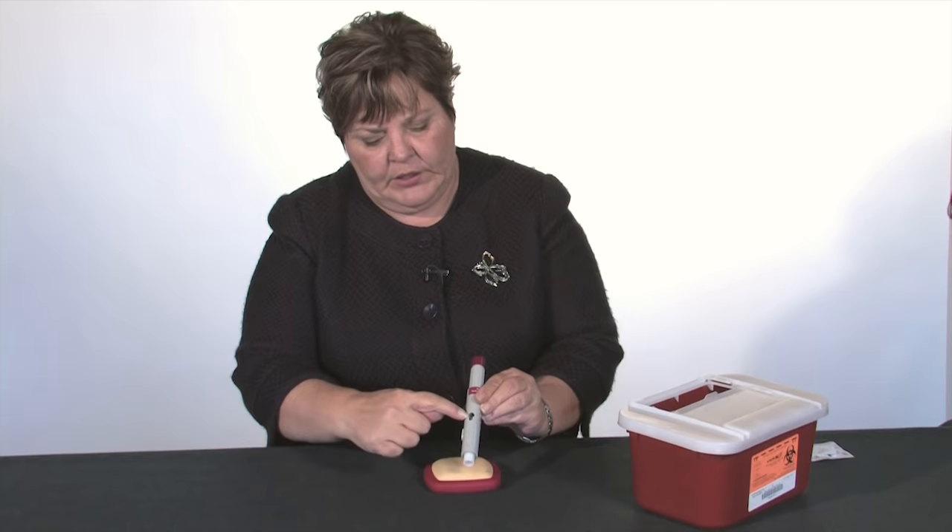So if you can see there, there's a little yellow indicator that came down. It takes about 10 seconds. Once you've finished, you're going to put this in your puncture-proof container, and that is how you inject Humira.